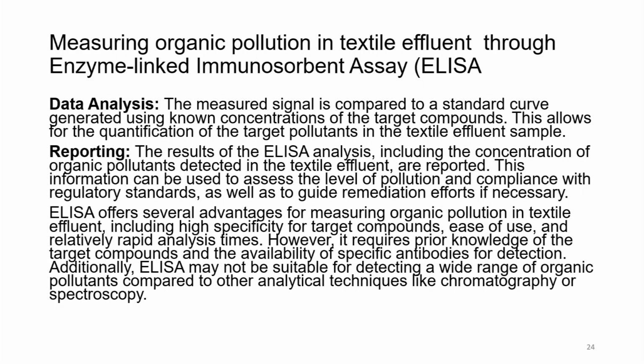ELISA offers several advantages for measuring organic pollution in the textile effluent, including high specificity for target compounds, ease of use, and relatively rapid analysis times. However, it requires prior knowledge of the target compound and the availability of specific antibodies for detection.